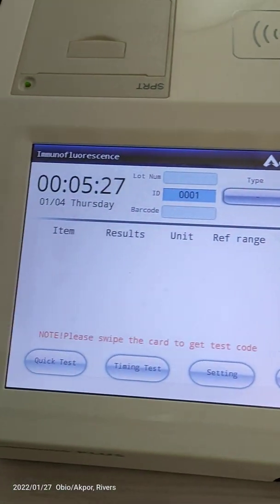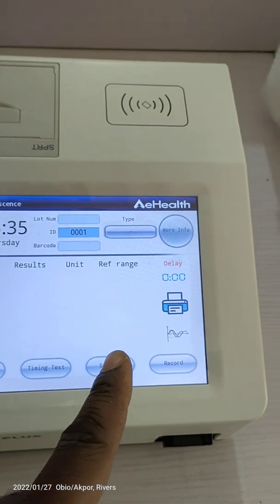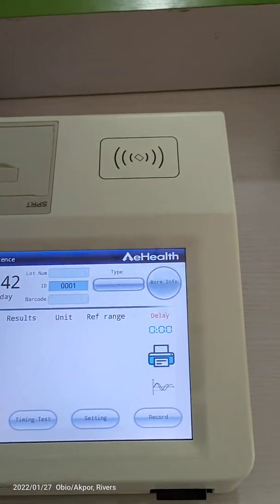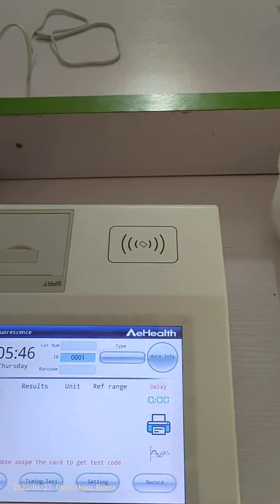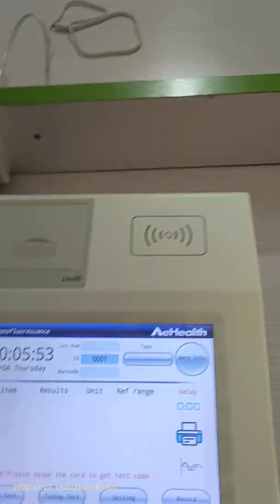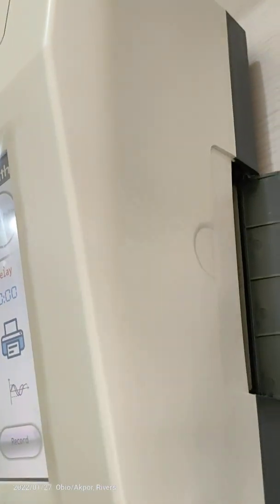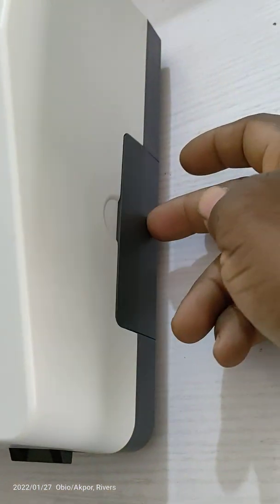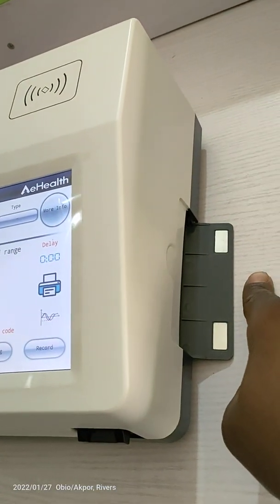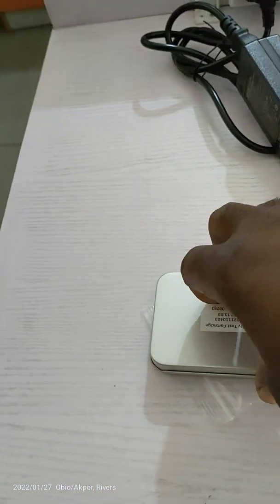It brings up the main testing interface. It's asking you to swipe the card to get the code for each test. Now the first thing we would like to do is QC. This is the waste pouch — you can close and open it anytime. Whenever you want to do any test, just open this so that once the cassette enters inside, after testing it will be discarded from this place.